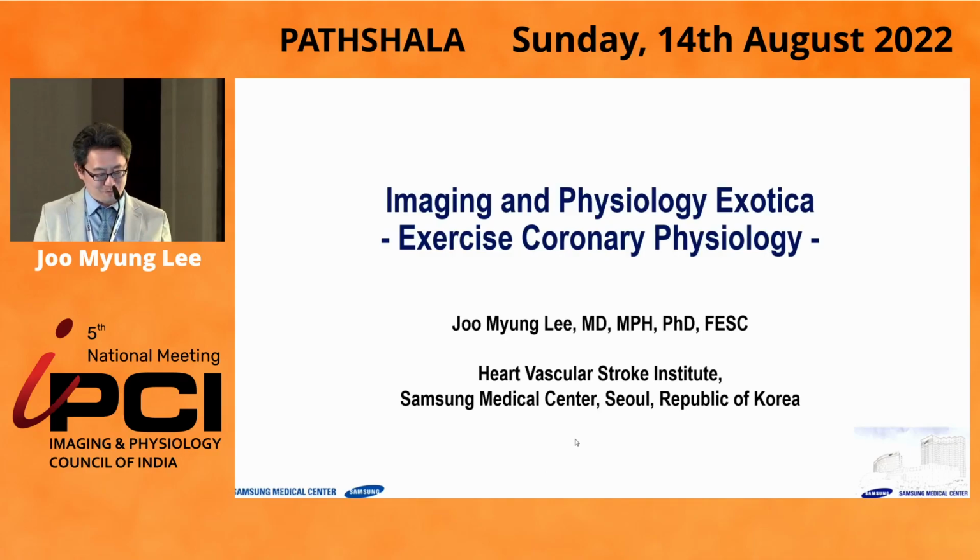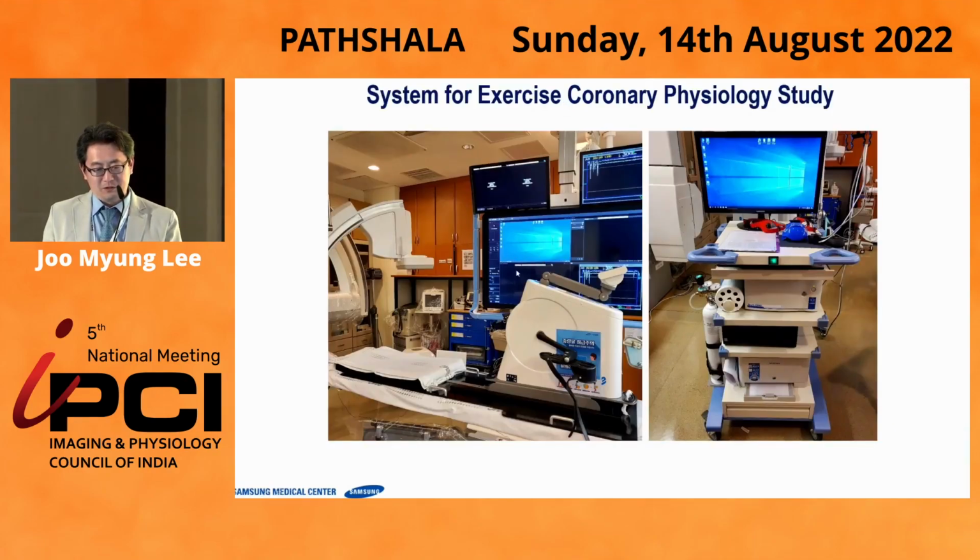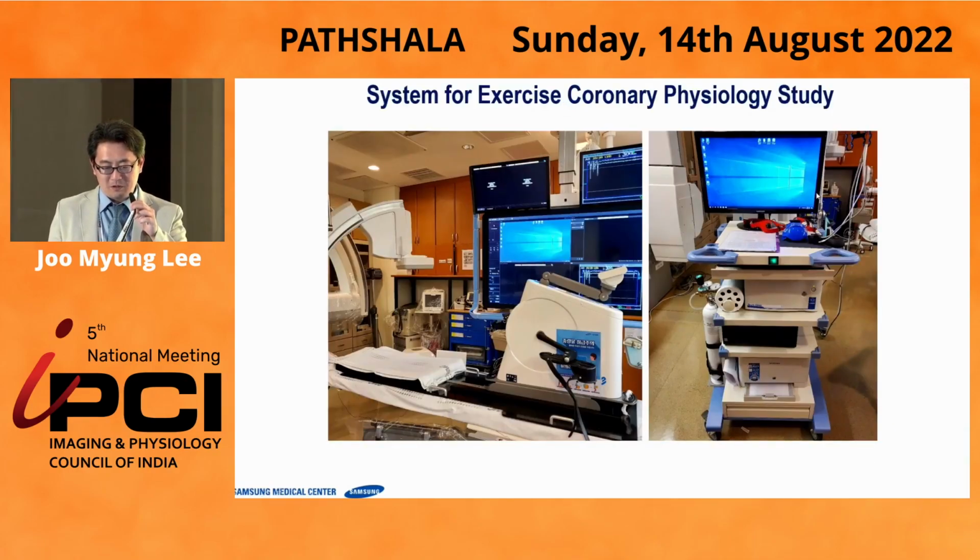So I'm going to talk about exercise coronary physiology. These are some setups in my hospital, in my cath lab. This is the angio machine, the Philips, and this is the supine bicycle exercise machine. We can attach or detach it when we are using this.